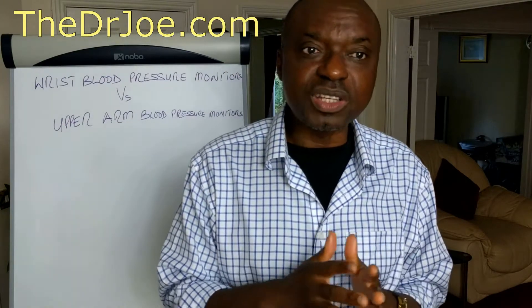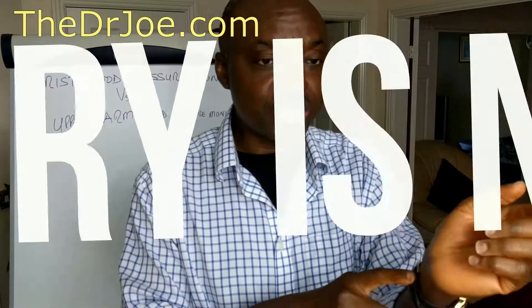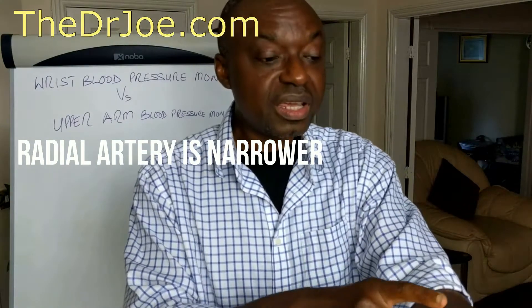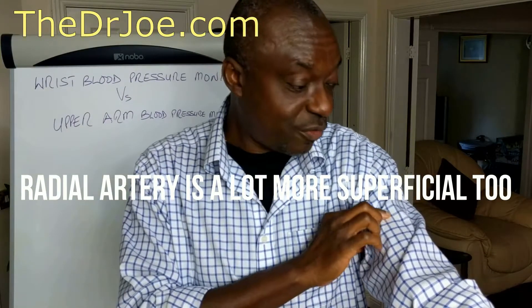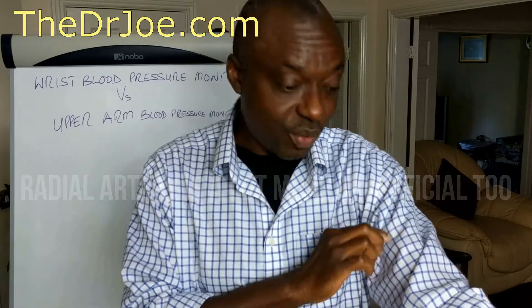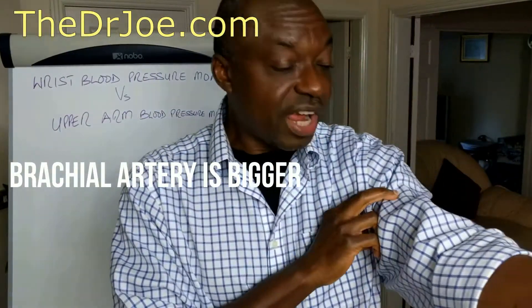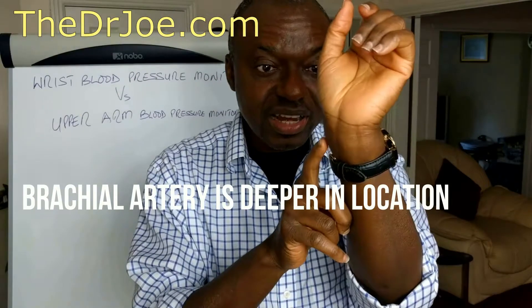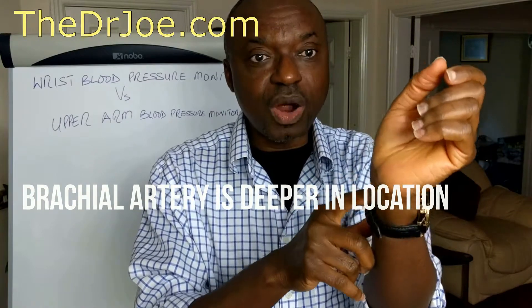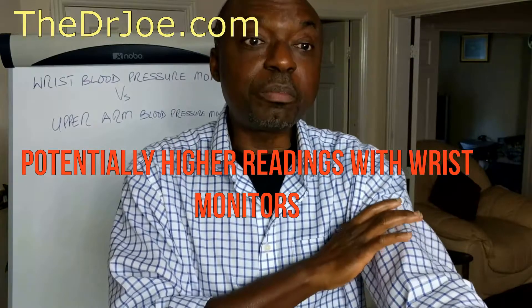The third point is that the artery you're trying to measure blood pressure from with the wrist monitor is called the radial artery. The radial artery is narrower and a lot more superficial compared to the brachial artery, from which you take the blood pressure with the upper arm monitors. The brachial artery is bigger and more deeply set. The blood pressure readings you get from the radial artery are usually higher compared to the brachial artery.